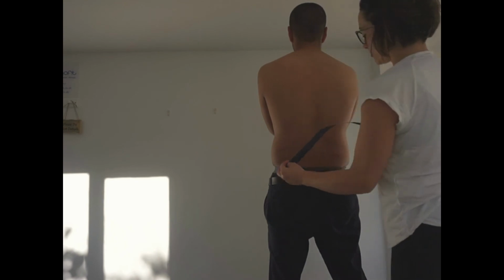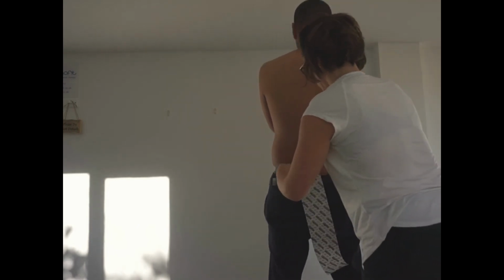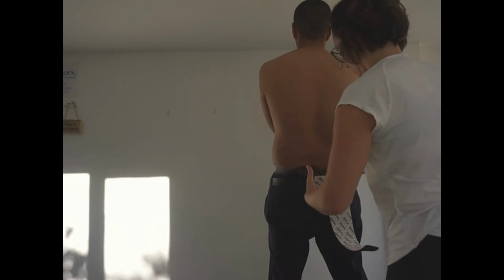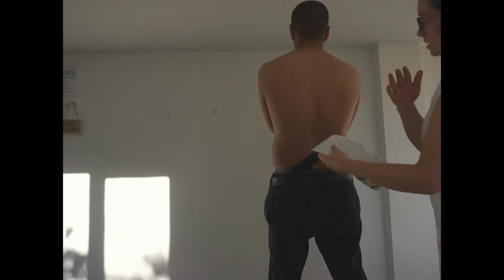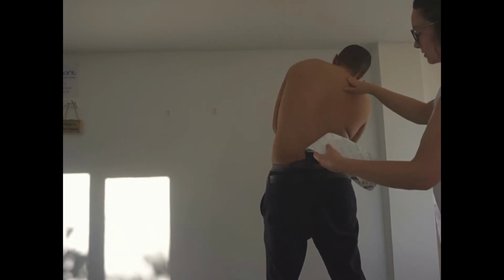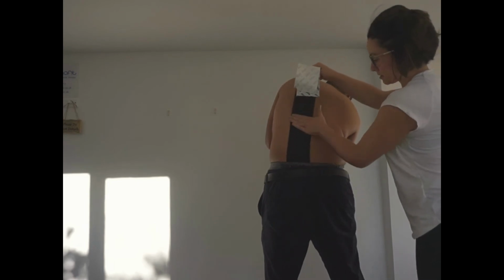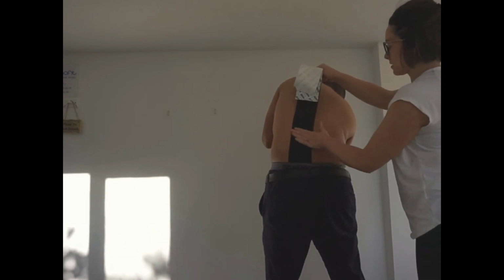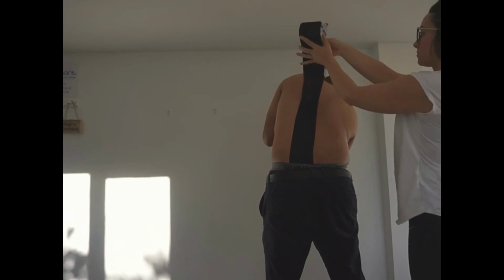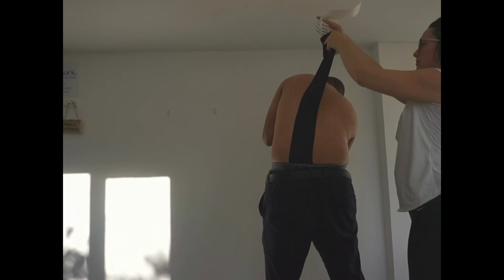I'm going to use a 10cm piece of tape so that we cover and stimulate more fascia in that line, and also because this client is quite tall. So I'm going to anchor at the back of the pelvis, and now I want to put all of the tissue of that line, the green line, on stretch. So I'm going to get my client to side bend to put that QL, that lumbar left side, on stretch, and I'm going to put a medium amount of stretch on the tape. Now I'm pausing halfway here because I want to change direction on the tape, so I'm just creating a midway anchor.